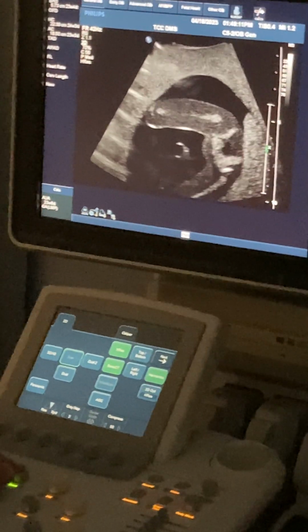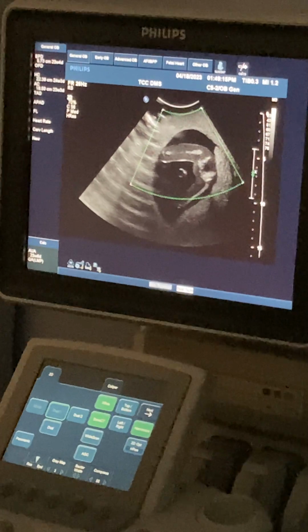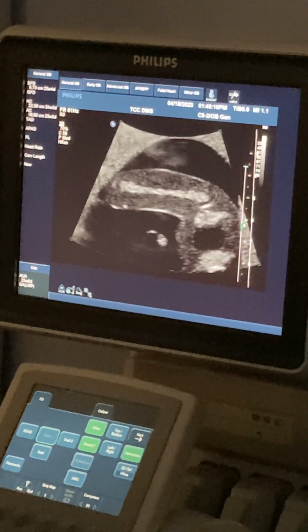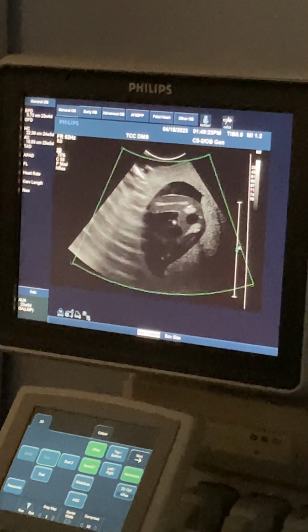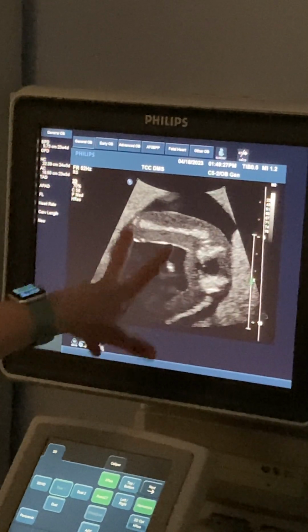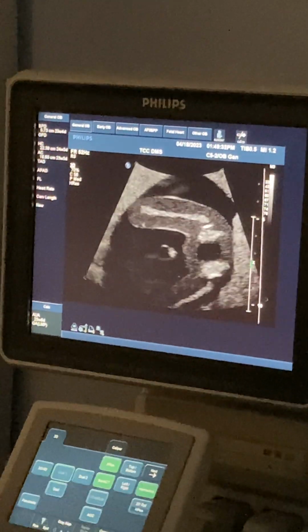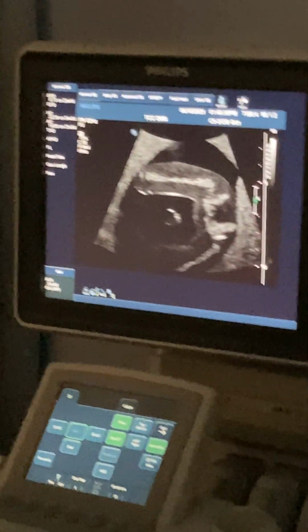I scan a little bit differently than Shay. I think Shay likes you guys to really optimize your image, right? So like femur. For me, when I scan at work, I like to give a little bit of context to my image. So like I can see that this is like a baby's bottom and femur here. But again, it's your preference. I'm not gonna mark you, I'm not gonna be like, no, that's wrong if you're super zoomed.